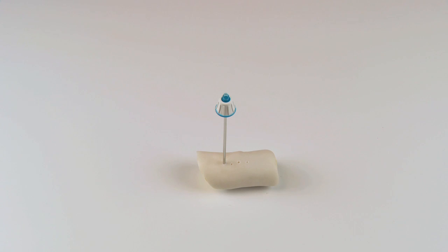Now we will perform a biopsy. The biopsy needle is designed for successful sampling of somewhat sclerotic lesions. More lytic lesions are also possible to sample by using a syringe pressed onto the lower fitting. For increased accuracy and precision during sampling, use of the depth gauge is recommended.